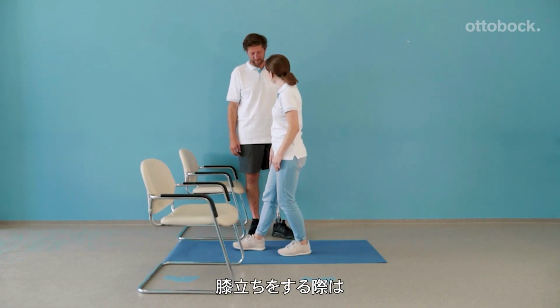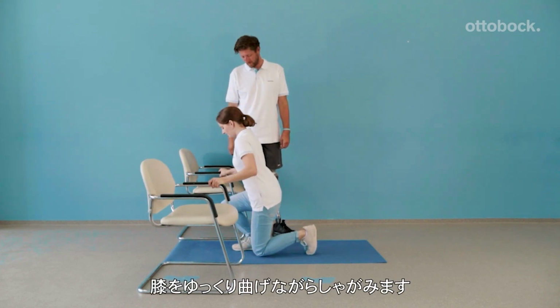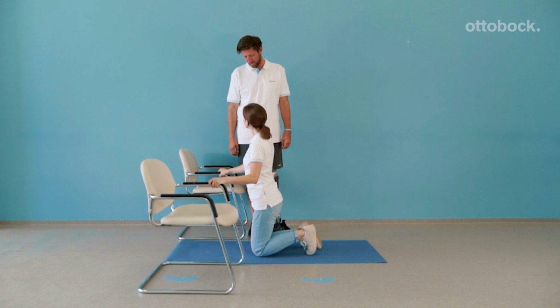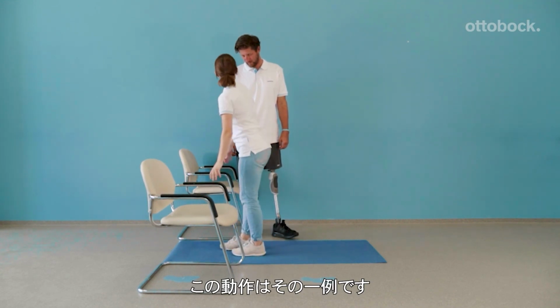With the 3R85, kneeling is possible using the hydraulic resistance. The shown method is only one example, and variations can also be trained.